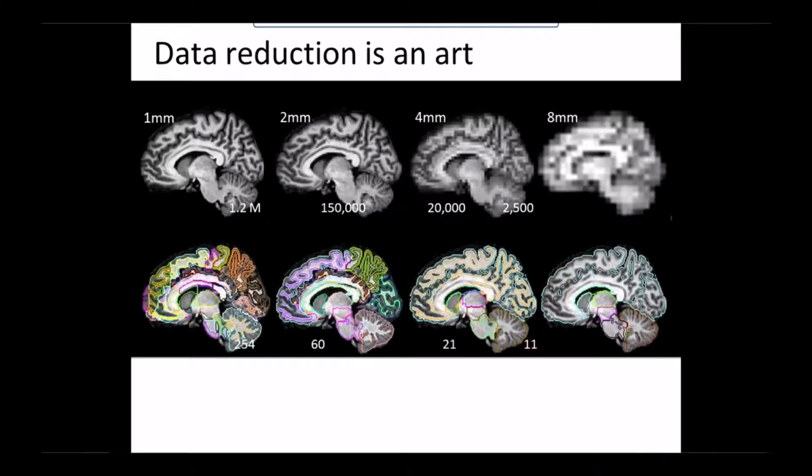So here's how we do it. It's not surprising: information is stored in a hierarchy, just like in language we often associate different semantic concepts at different levels or a different hierarchy. So we reduce the dimension by representing the different brain parts at the different scales at which they're manipulated. In one part of our representation, we might only have 11 structures representing the entire right side of the brain, which would be half of the 1 million voxels.